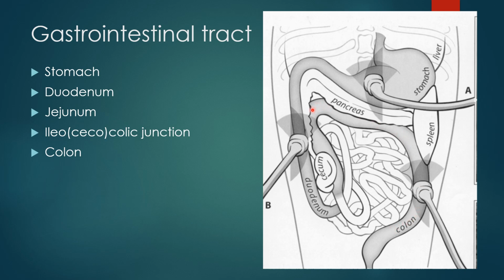For the purposes of this talk and for your lab in OSCE, we're really just going to be talking about intestines and how to recognize them.